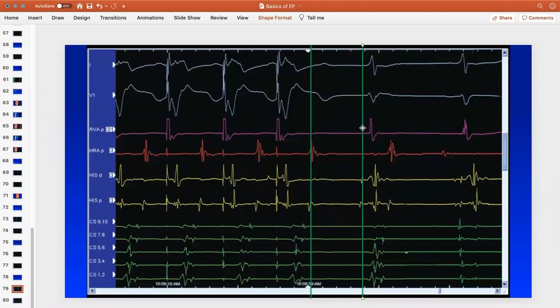That's a good question. When we talk about an echo, we have an AV nodal echo beat that went back through the AV node, and we have an AV echo beat that went through a pathway. This is an excellent question. So this is an AV echo beat. So you have one run of tachycardia, but the echo did not go through the AV node. The echo actually went through the pathway. So this is an AV echo beat. It's not an AV nodal echo beat because you used the pathway. That's an excellent question.